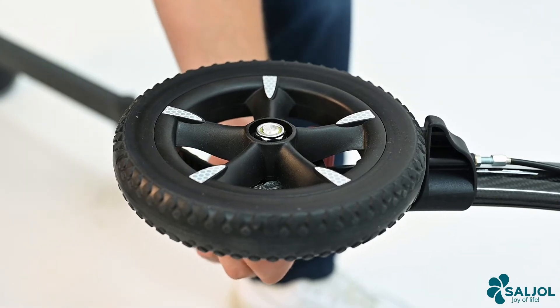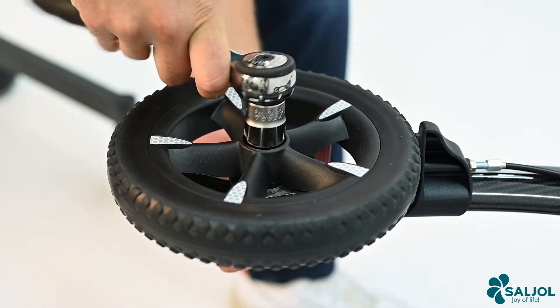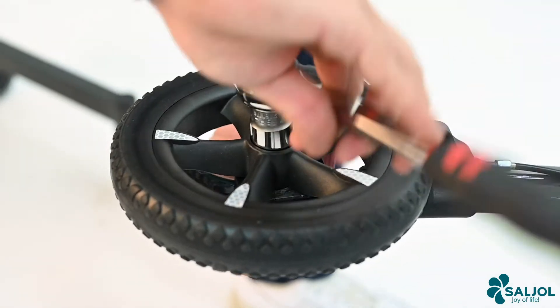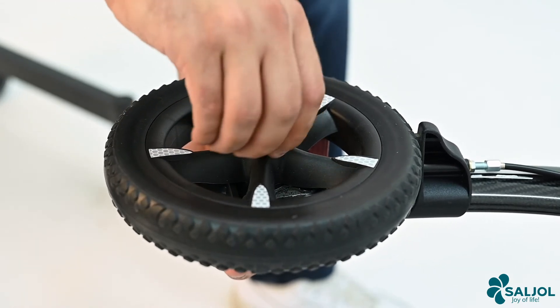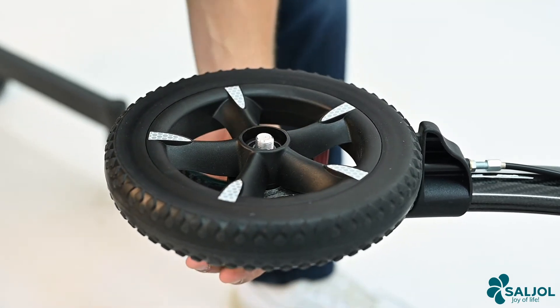Place the allen key from below and the ratchet from above, then loosen the nut. Unscrew the nut by hand and remove the wheel.